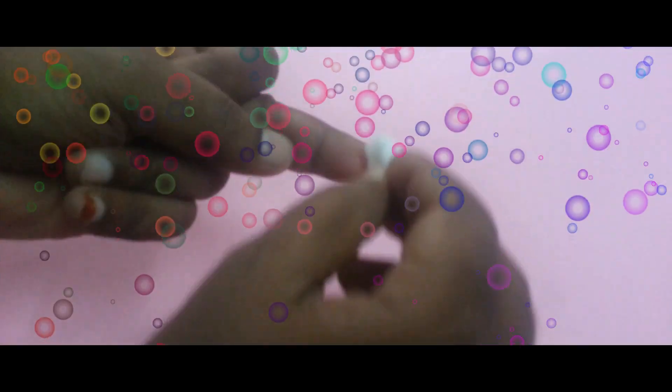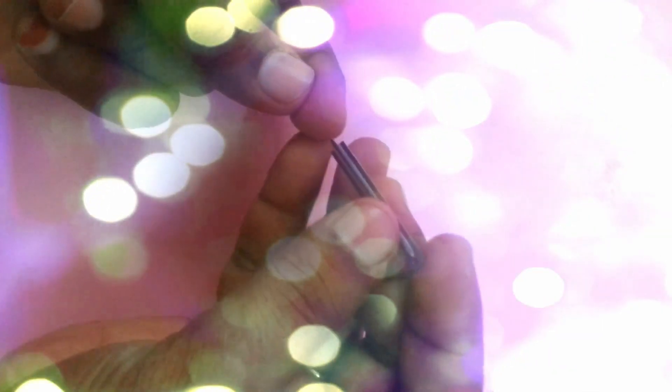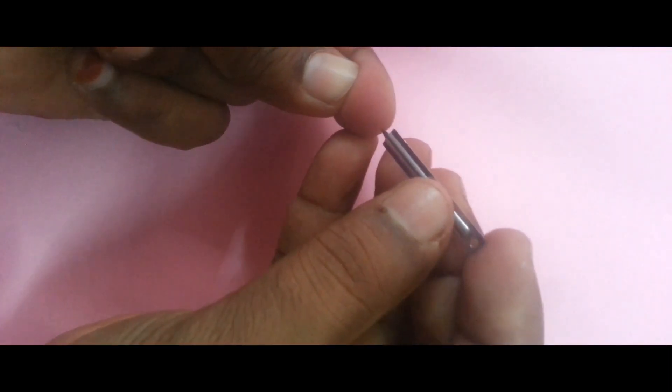First, open the pot and remove the test device and loop as soon as possible. Clean your finger with a spirit swipe, then prick the finger with a lancet and pick up the blood with a disposable microliter sample loop.